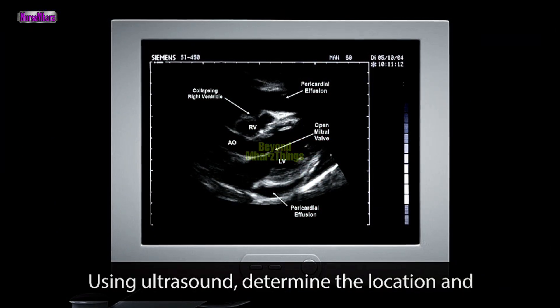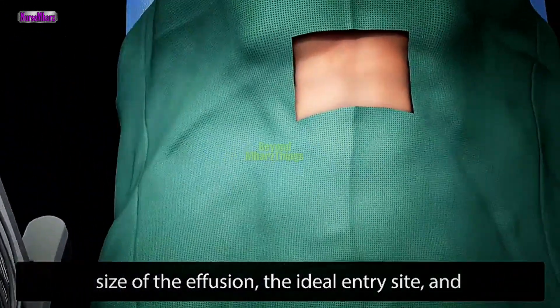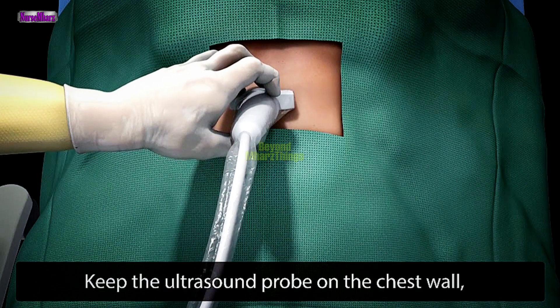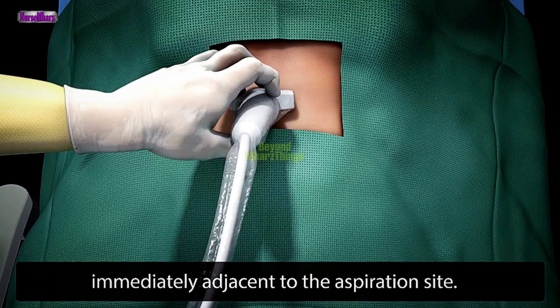Using ultrasound, determine the location and size of the effusion, the ideal entry site, and needle trajectory for the pericardiocentesis. Keep the ultrasound probe on the chest wall immediately adjacent to the aspiration site.